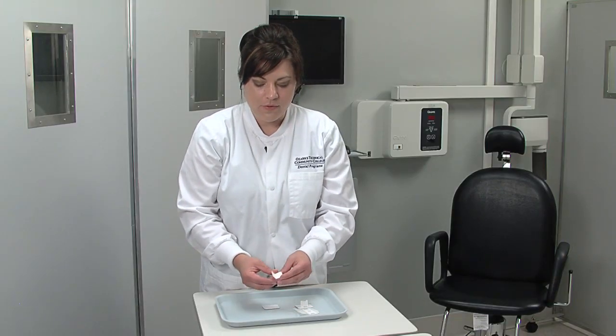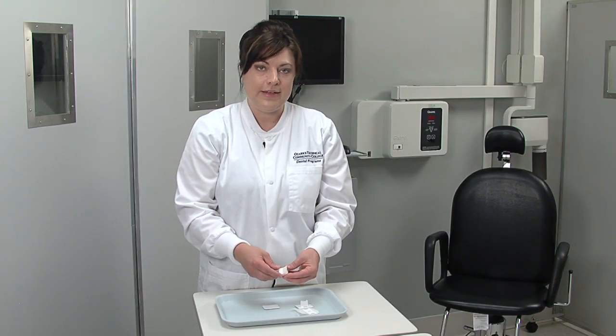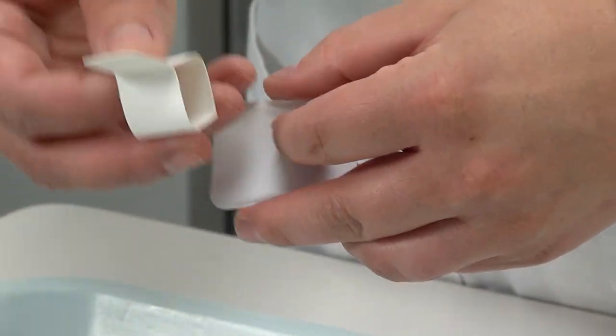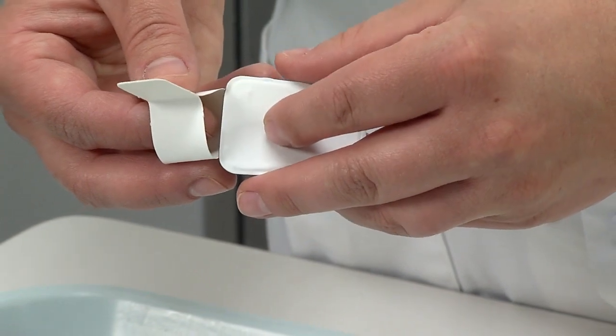The second type of film holder is the bite wing loop, and it does exactly the same thing. It's also made of cardboard, only the difference is that it actually loops around the film rather than sticking to it.